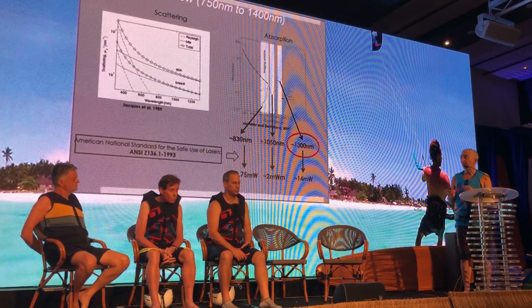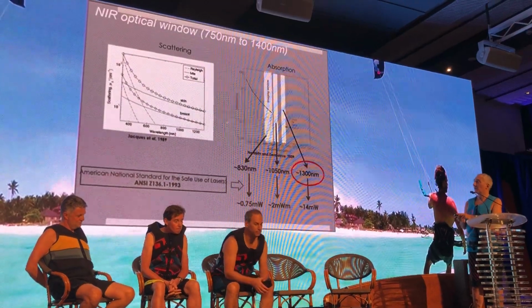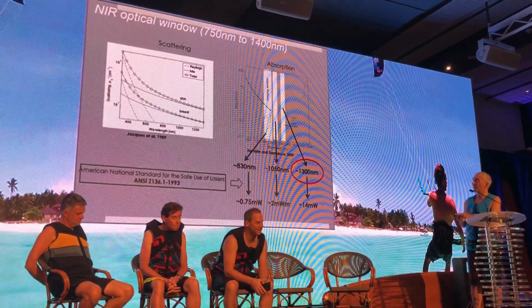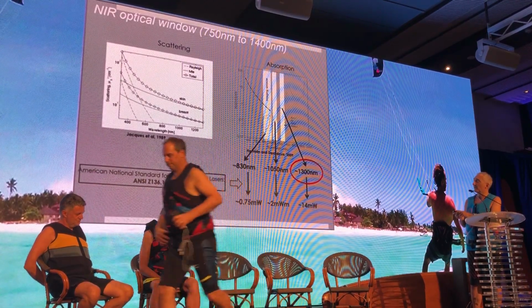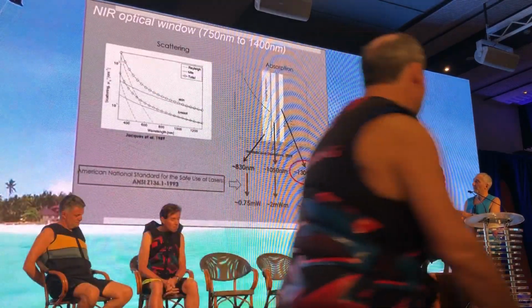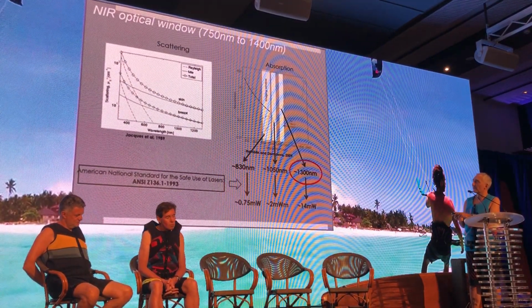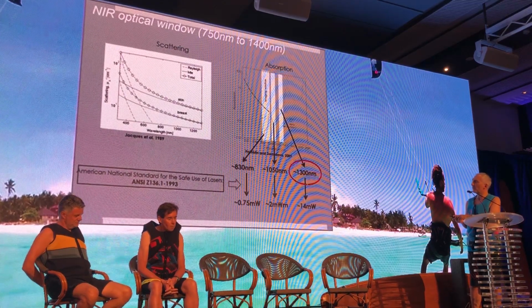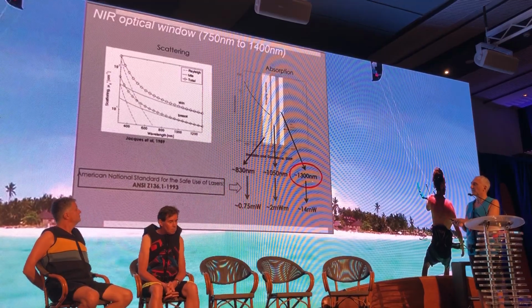Talking about OCT, we should think just for a moment about how the frequencies have been chosen. There are so-called imaging windows for living tissues that are useful and where there is less absorption. For anterior segment OCTs, it is usually 1300 nanometers.